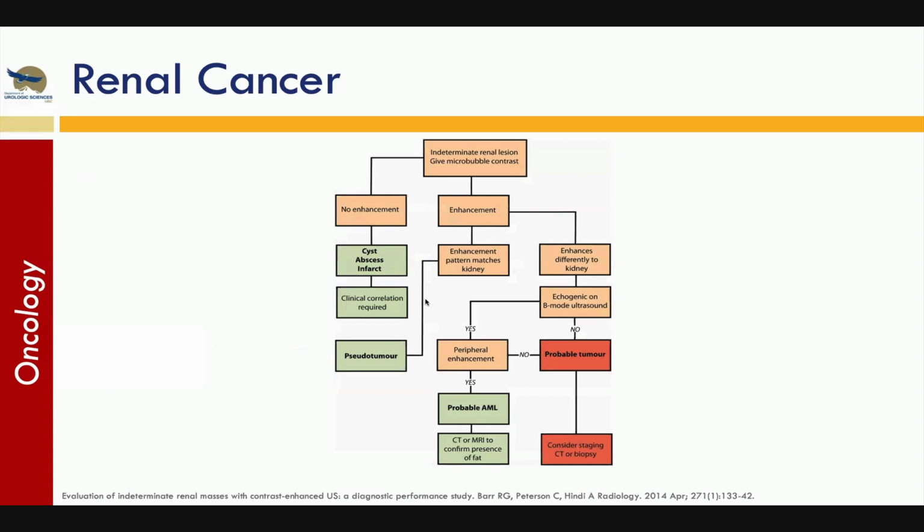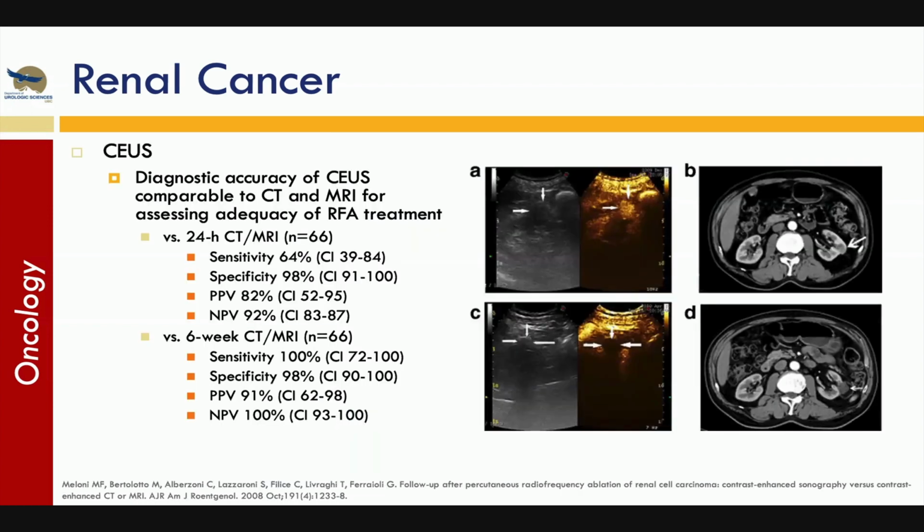And this is kind of the only guideline I found really about the use of any of these newer ultrasound modalities clinically. It suggests a possible pathway for looking at lesions, which will include contrast-enhanced ultrasound. And again, this is just an image for you to look at, the top versus the bottom, the difference in how much contrast-enhanced images can help you see what the mass looks like.